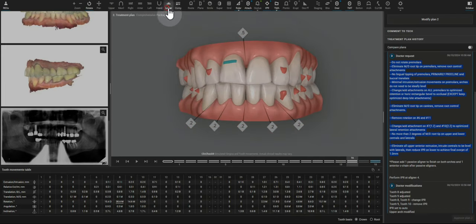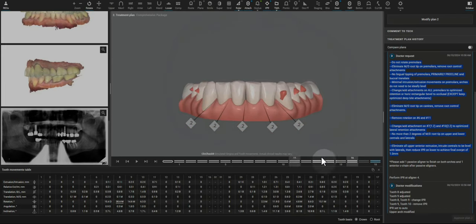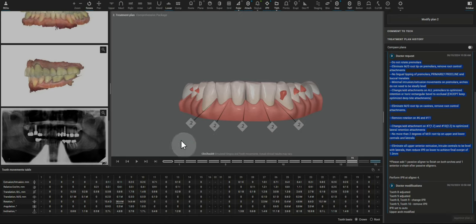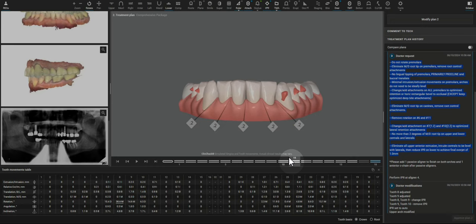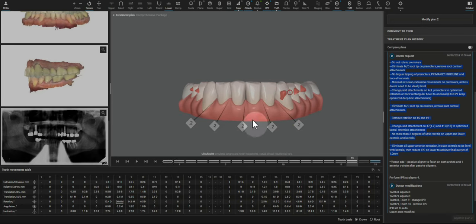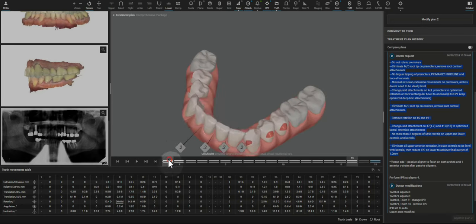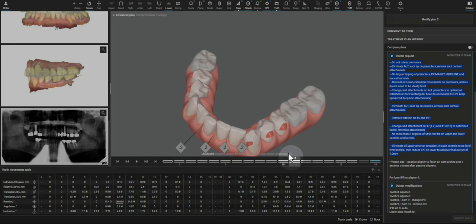I want to talk about the lower movements. We've eliminated the majority of the mesiodistal angulation and now I'm looking at 22. It mostly needs to rotate. That's what I would expect the patient to be looking for.